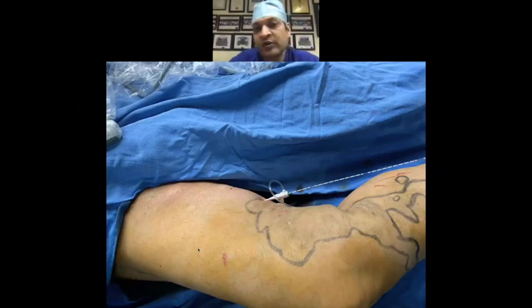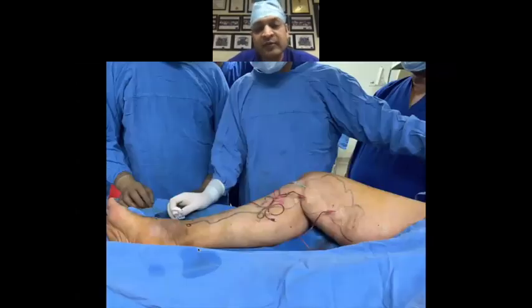So here we have put in the 6 French sheath. We are using a double ring laser radial fiber. It's a 1940 laser fiber. So once we have treated that, then you have a lot of varicosities down there. Now there are various ways you can treat the varicosities here. You can leave them alone and come another day.